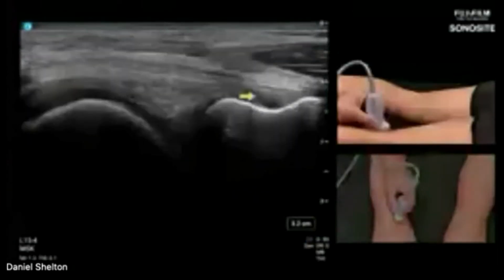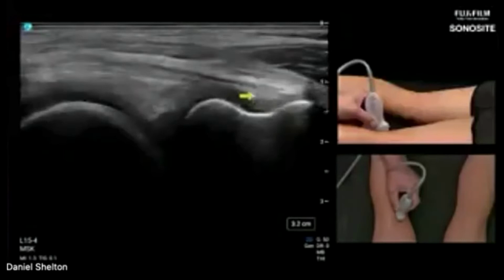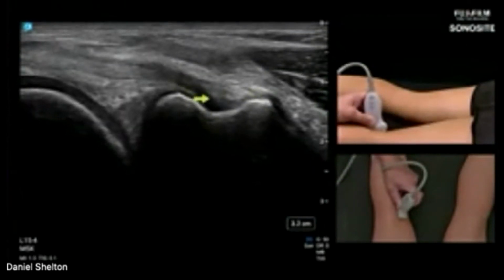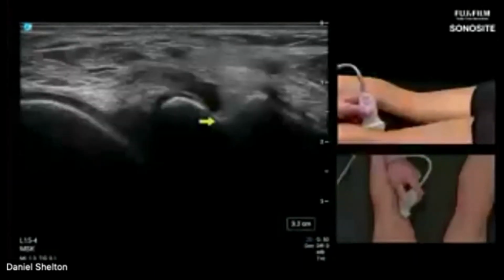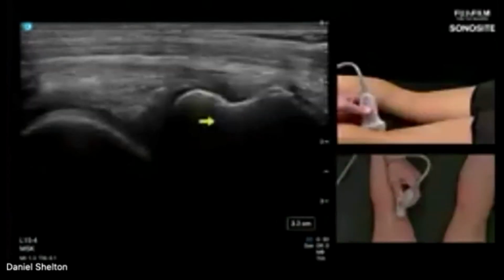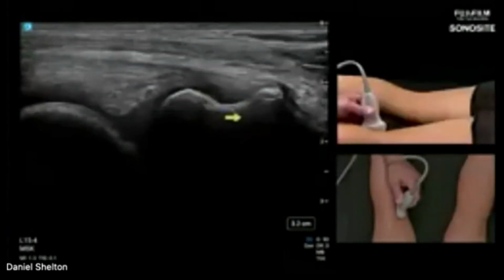And you will see hamstring tears and avulsions down here. Tendinosis is very prevalent in this area. Just like a rotator cuff, a supraspinatus, look at the tendon diving. This is totally normal, and you just have to dig the transducer in distally, do that heel-toe maneuver to avoid calling that tendinosis or some sort of tear or lesion there. But here's our semimembranosus diving into the posterior tibia.